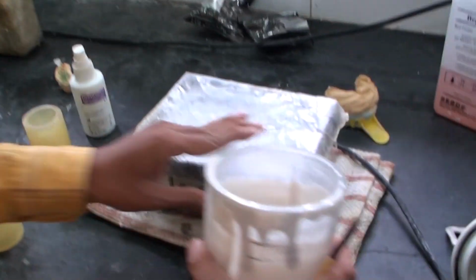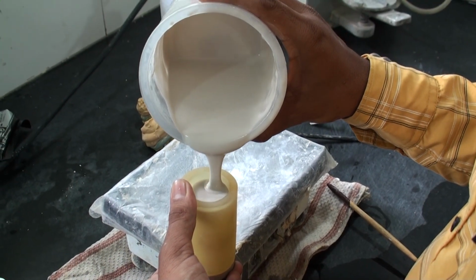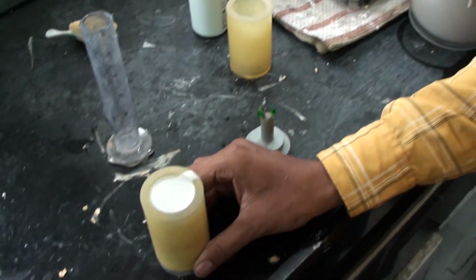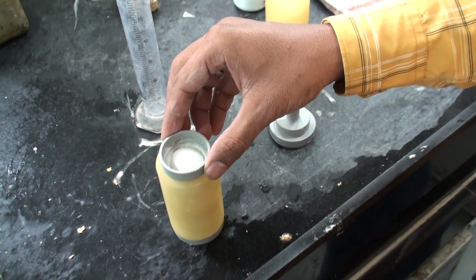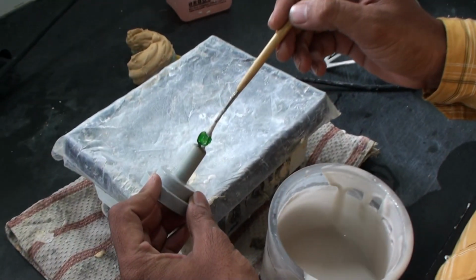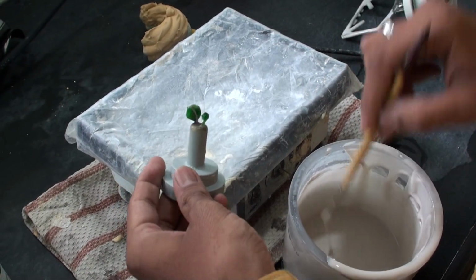And then we start putting it into the ring. There's one ring that's being filled up. Put it on the side. And actually you have to paint on the wax pattern with the investment material. So here you can see he's taking a little brush and he's painting the investment material onto the wax pattern.